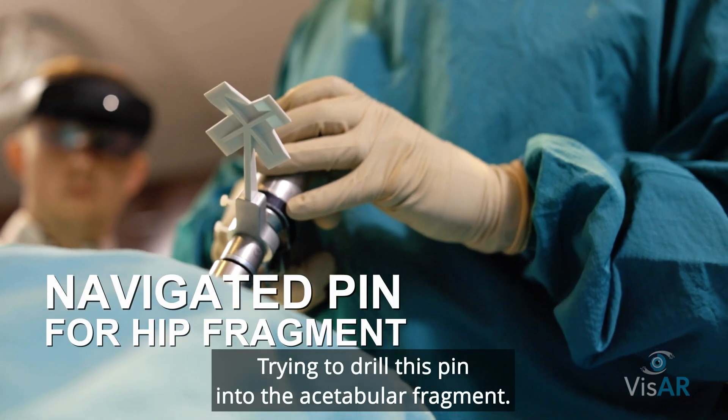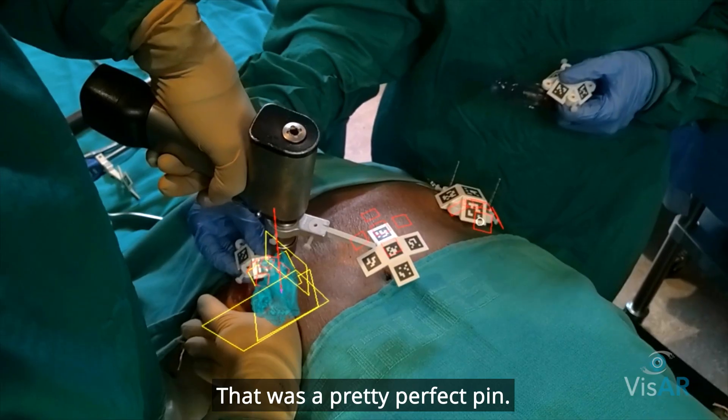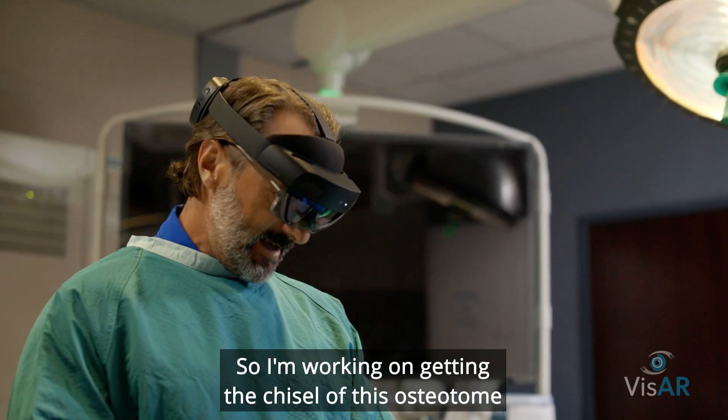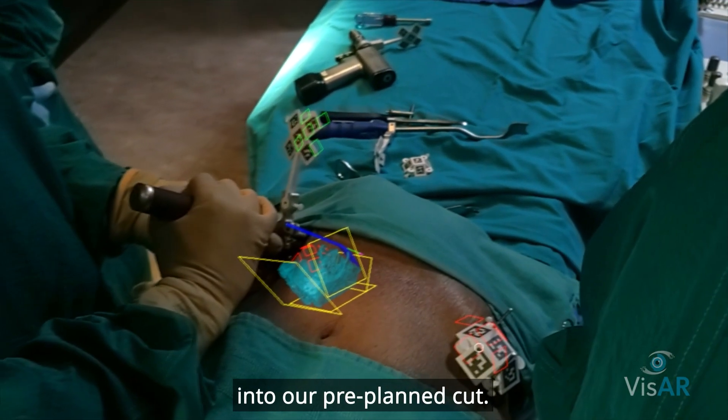Trying to drill this pin into the acetabular fragment — that was a pretty perfect pin. Now I'm working on getting the chisel of this osteotome into our pre-planned cut.